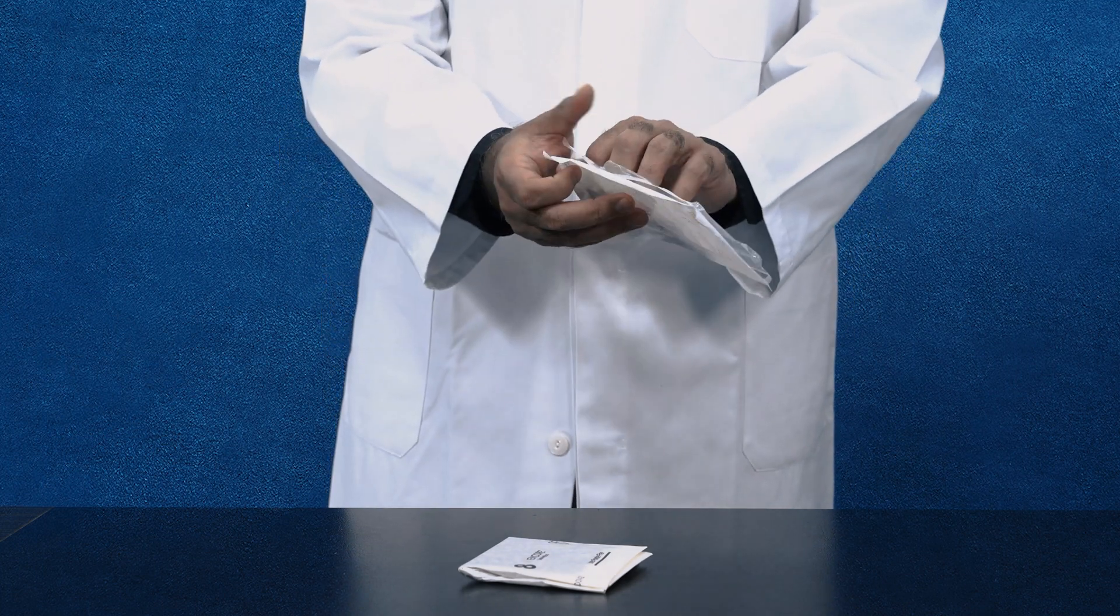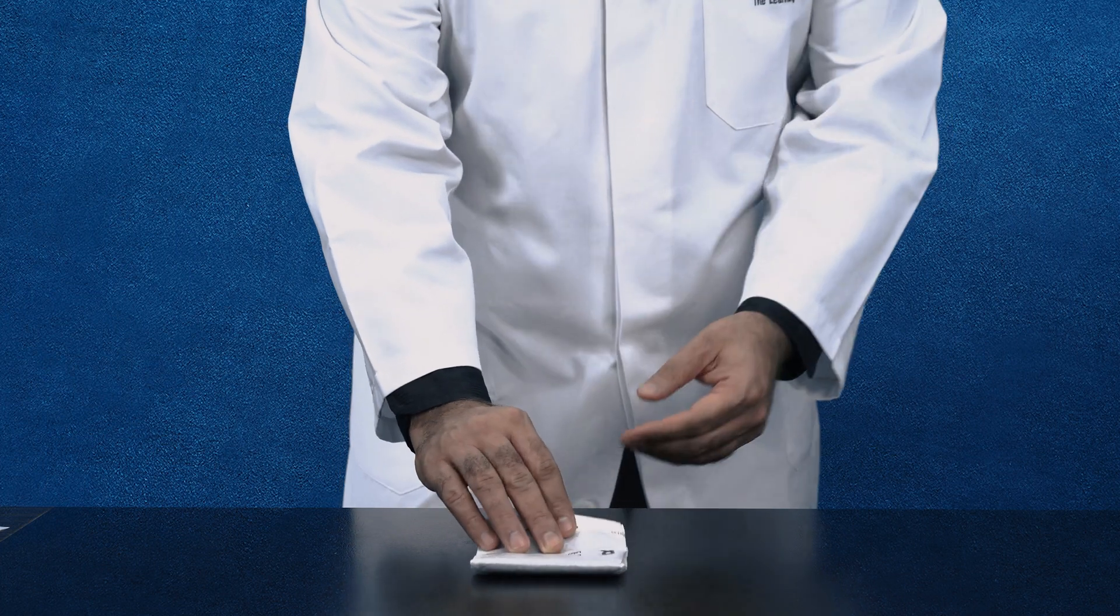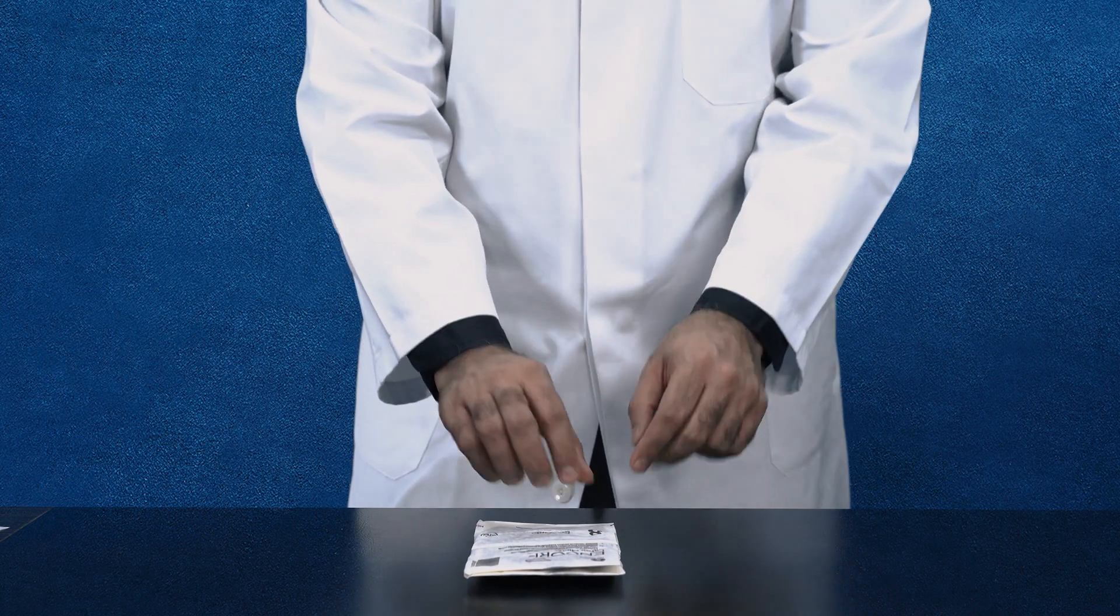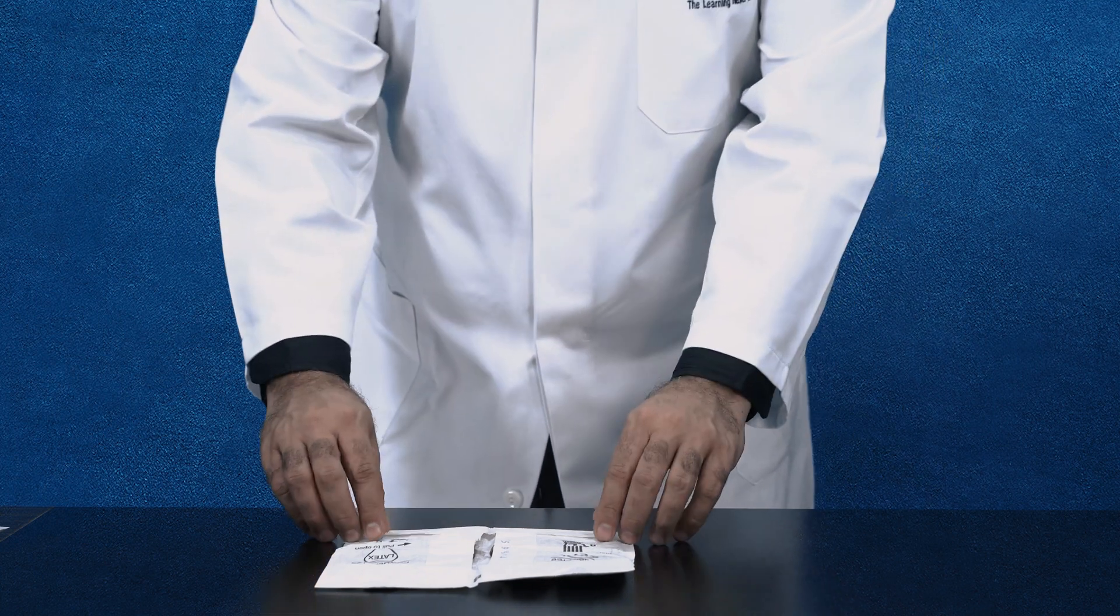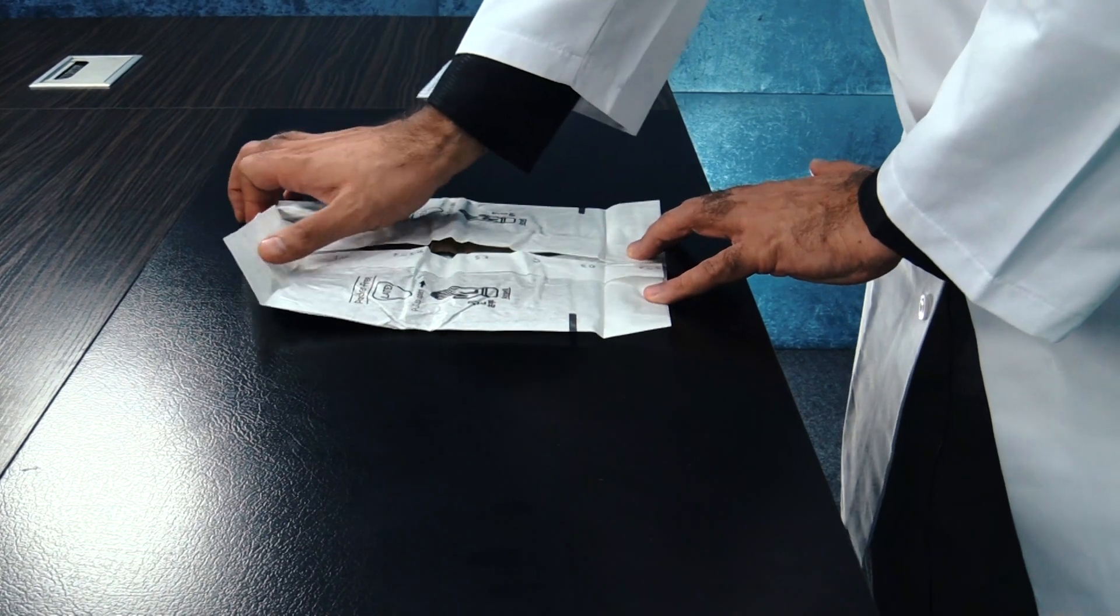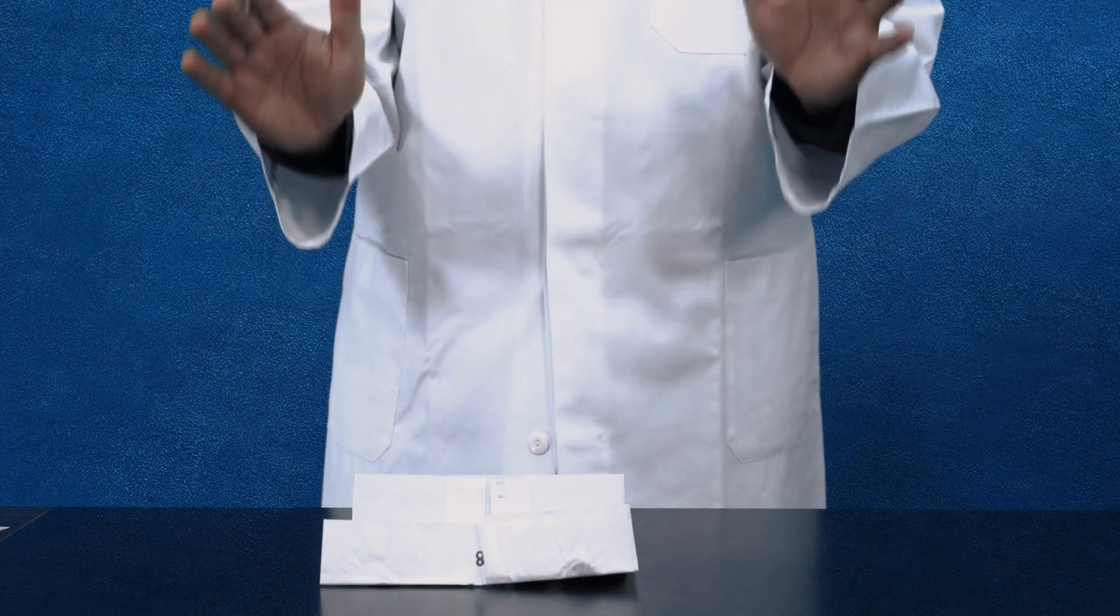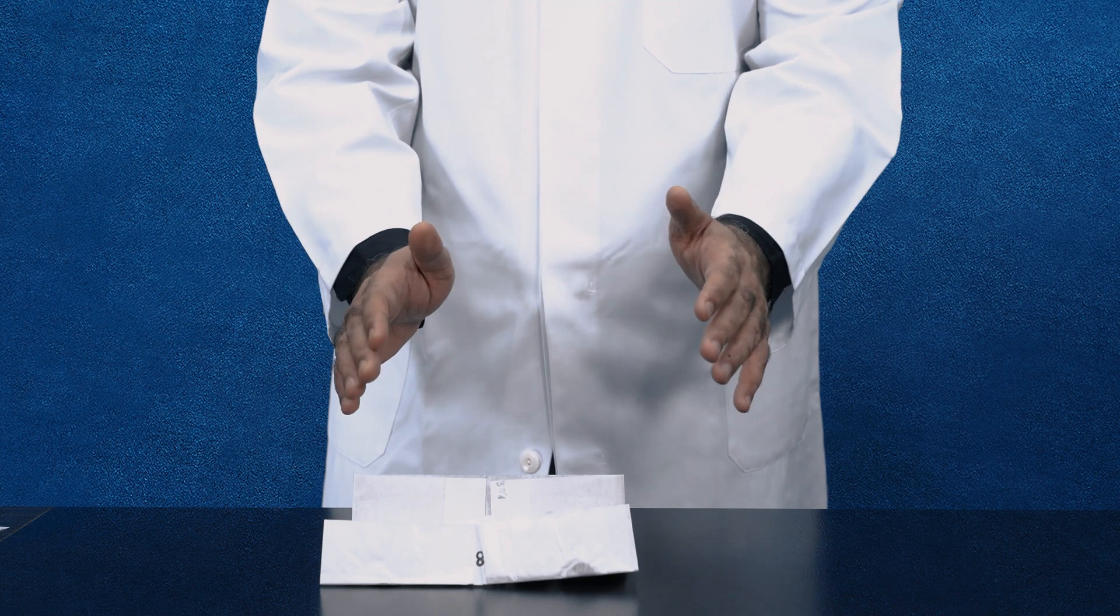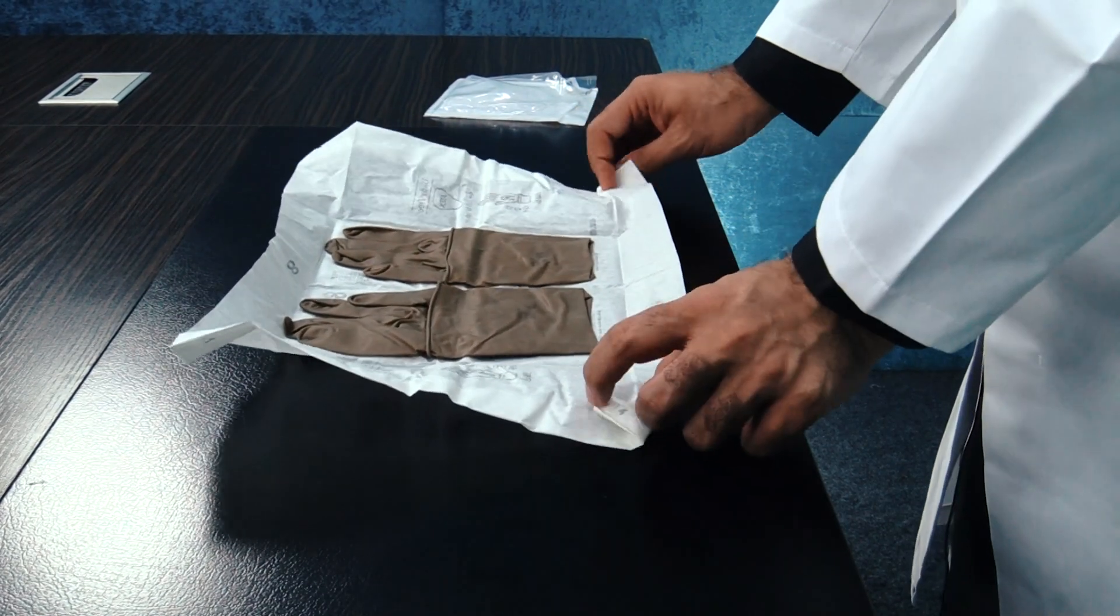Now then I have to open my gloves. This area, the next layer, the next layer, and the next layer - they all can be touched by my hands. Why are we doing it? Assuming that our hands are not sterile, although we have scrubbed them. Then we open the flaps and we stabilize the sheet of paper.